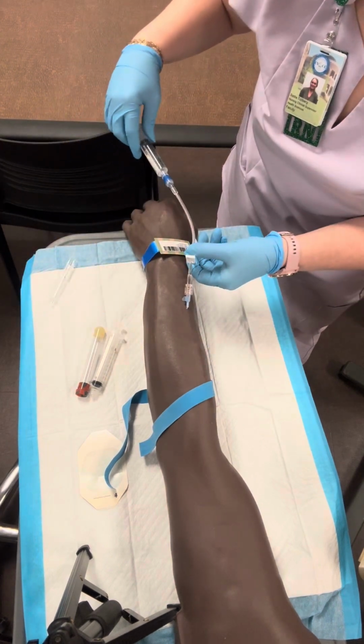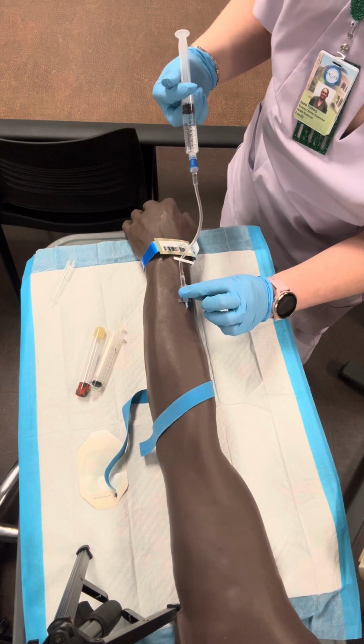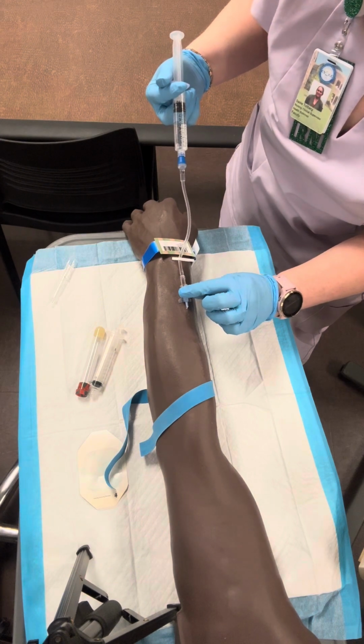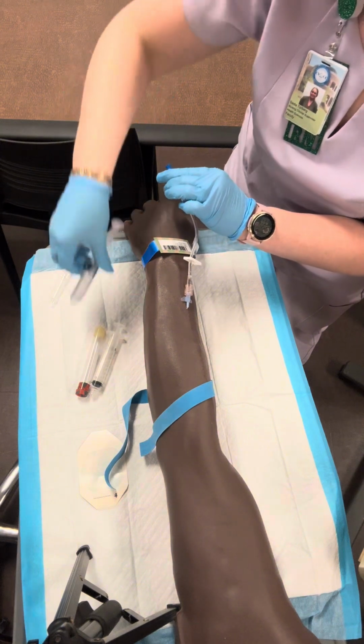I'm going to unclamp this and I'm going to flush, not for real, but I'm going to say that I'm flushing it. And it is patent, no signs of infiltration or inflammation. And then I'm going to clamp it shut, take off my flush here.